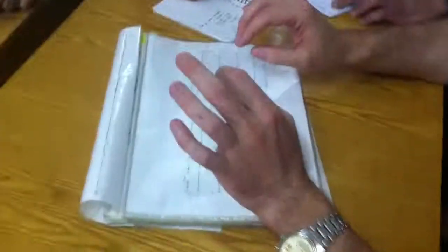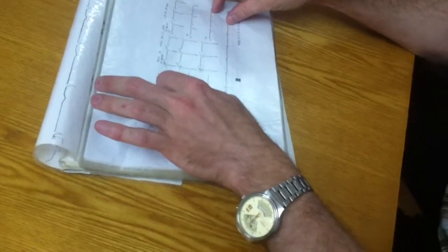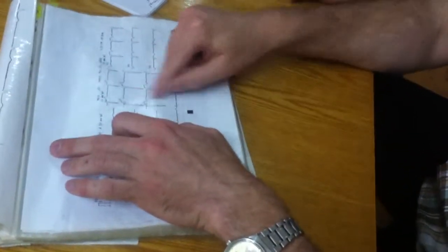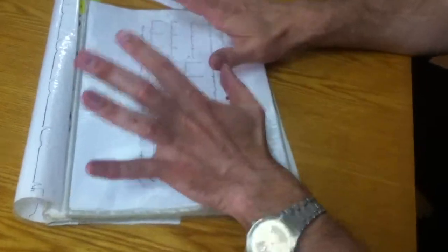So now we will see the signs of atrial fibrillation. On the whole, atrial fibrillation is absence of the P wave before each complex. Also, unequal RR intervals. And third is small f wave. It's not an obligatory sign, but absence of P wave and, as a rule, unequal RR intervals are obligatory.